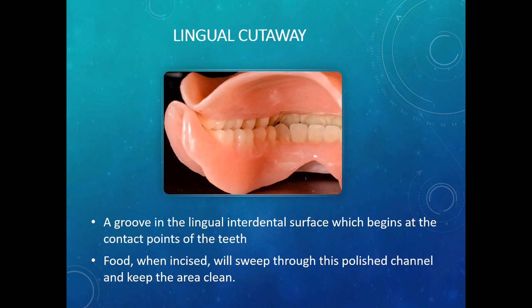The reason for the lingual cutaway is that food, when it is incised, will sweep through this polished channel, and so it will keep the area clean. It also prevents an unnatural exposure of plastic behind the tip of the papillae. So this is the purpose of lingual cutaway.